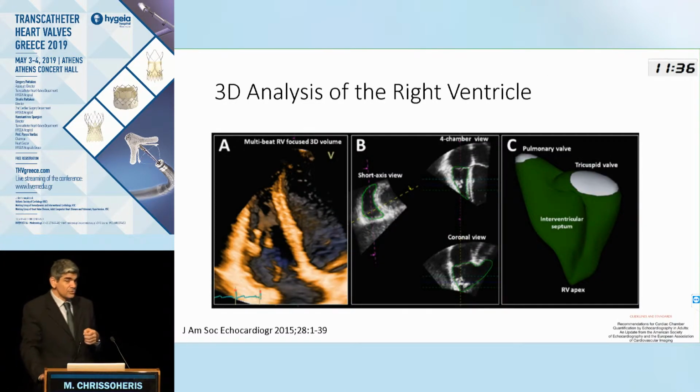The newer modalities are essentially three-dimensional evaluation of the tricuspid and the right ventricle from a transthoracic approach.